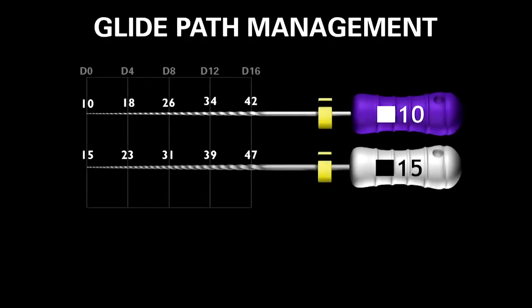The instruments traditionally used for glide path management have been the ISO 10 and 15 hand files. Notice these are fixed-tapered files made of stainless steel. The 15 file is 50% bigger at its working tip than the 10 file. When you factor in that they're stainless steel with a fixed taper and a large percentage change between files, the 15 file led to many iatrogenic problems internationally: blocks, ledges, transportations, and regrettable outcomes.